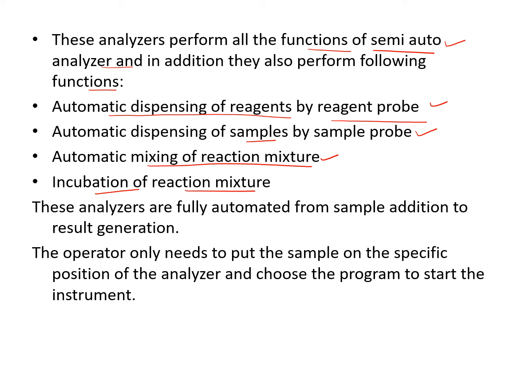Okay, there is no need for separate incubation. We do not need to place it in an incubator separately to incubate. The incubation will happen in the fully automated analyzer itself. Reagent pipetting is done by the machine, sample pipetting is done by the machine, mixing is done by the machine, and the incubation is done by the machine. These all in the semi-auto analyzer are done by the lab technician.